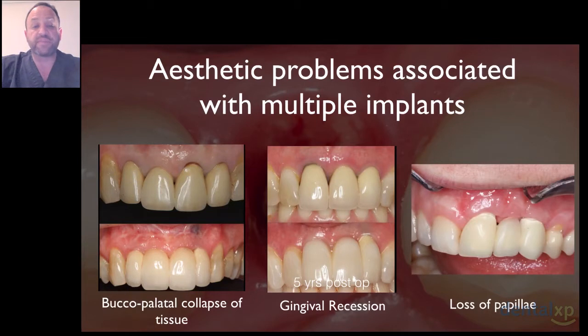The other thing that happens very extensively, as you can see in this case where we had a patient with a very high lip line, a very high aesthetic value case, is the massive amount of destruction and resorption of the ridge and the pontic sites. We can come in and do multiple grafts, but essentially we're never going to get that whole thing back to where it was. Again, pink composite does help us in these kinds of scenarios, but in the day when this case was done, we weren't really using too much pink composite. So from that point of view, the case was really a disaster.